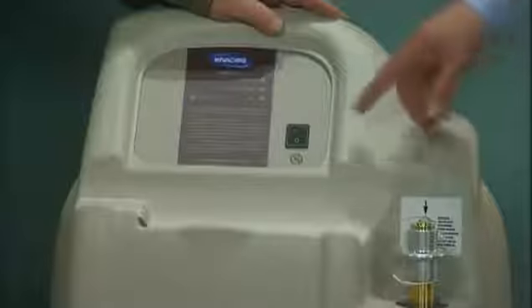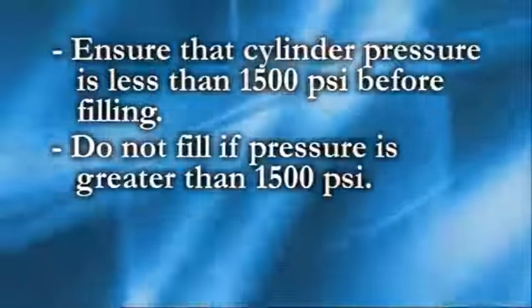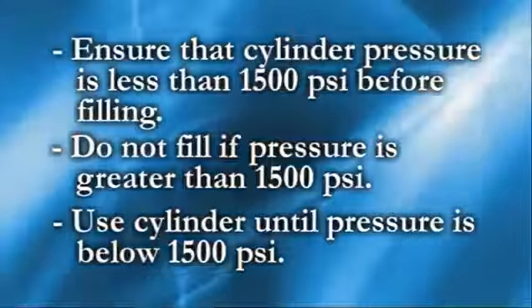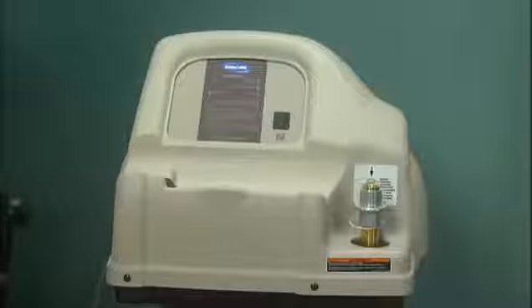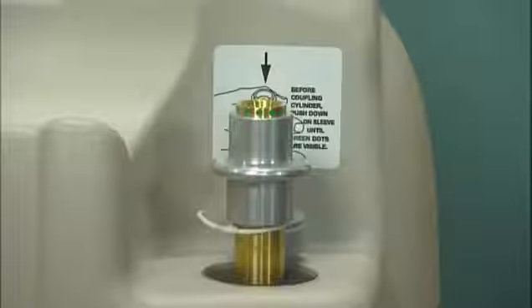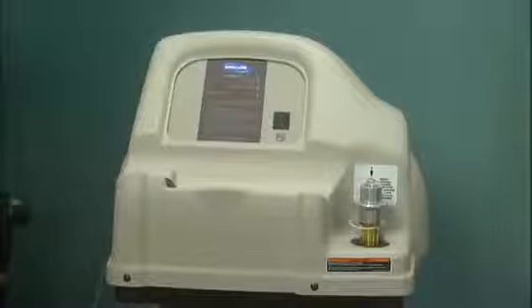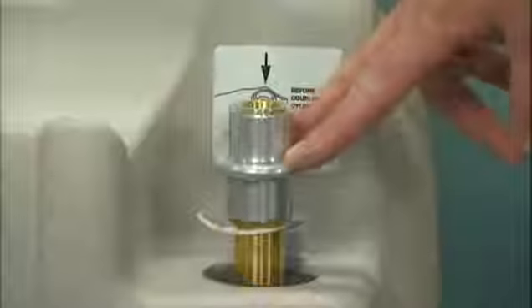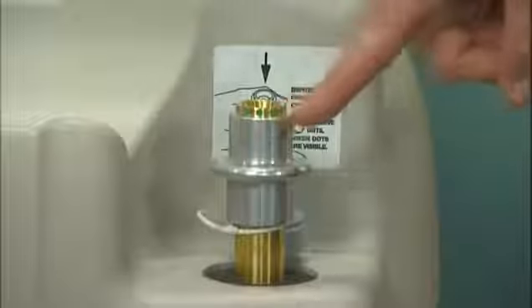Make sure the unit is turned off. Ensure that the cylinder pressure is less than 1500 psi before filling. If the cylinder pressure is greater than 1500 psi, do not attempt to fill the cylinder. Go ahead and use your cylinder until the pressure is below 1500 psi, and then fill the cylinder. Check the connector on the fill port to make sure the outer ring is in the down position and the green dots are visible. If the outer ring is in the up position and the green dots are not visible, push down on the outer ring to reset the connector. The green dots should now be visible.